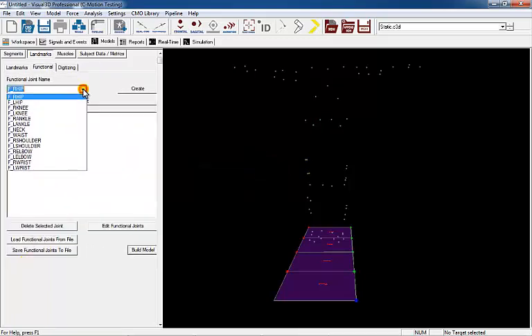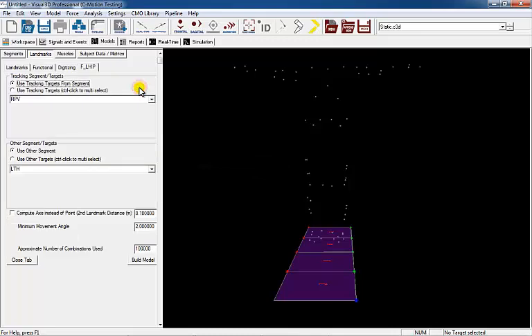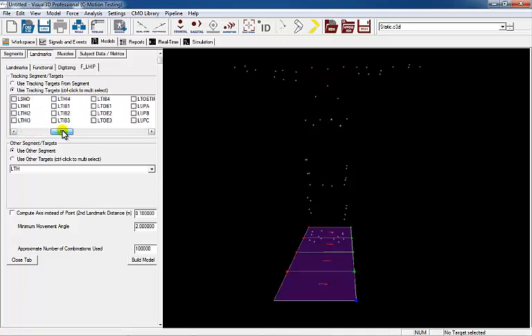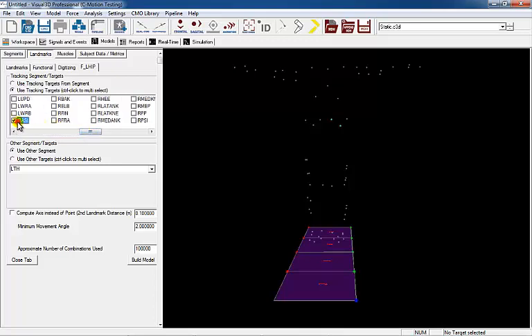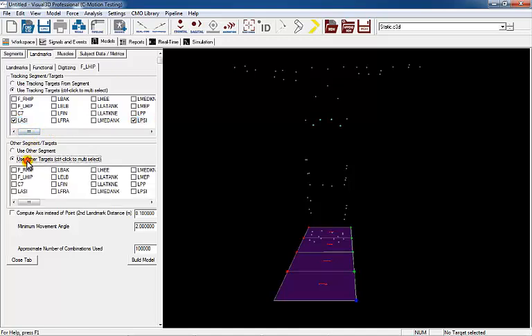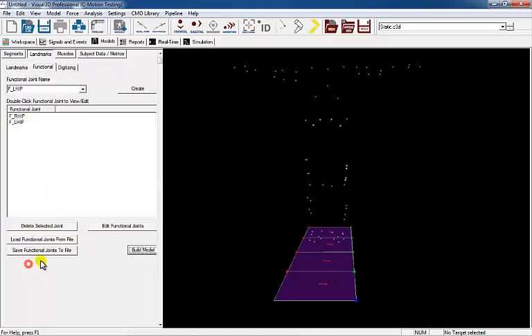Select FL hip and create. Define the tracking targets for the parent and child segments of the left hip joint. Once the targets are defined, select Close tab.